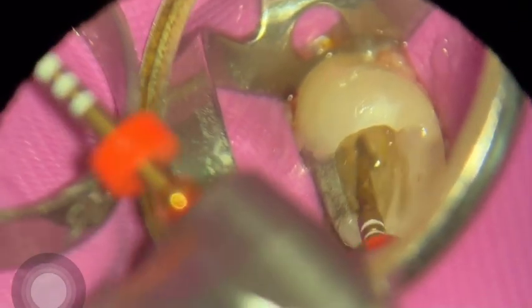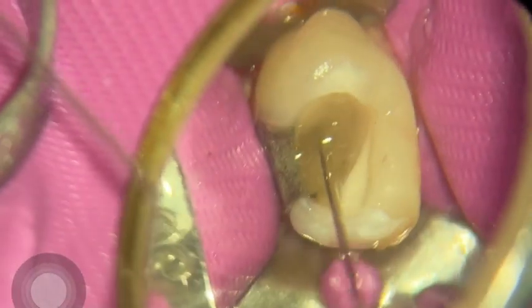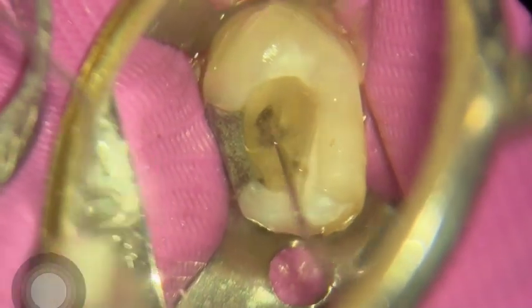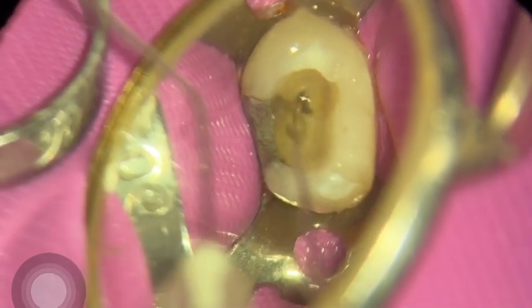Don't spend too much time searching for extra canals — just prepare what you can see and then come back to it. There's also a psychological benefit: having prepared the two canals, I feel like I have time and confidence to search for more. Now I'm showing you the F2 finisher — what you want to see is debris on the apical flutes of your instrument, because that tells you you've prepared the apical part of the root canal sufficiently. I did the buccal one and I can see the flutes, so I'm happy. Same with the palatal. There's debris there, so I'll finish my preparation with the F2. Lots of hypochloride — recapitulate, make sure you've got patency and a good glide path.